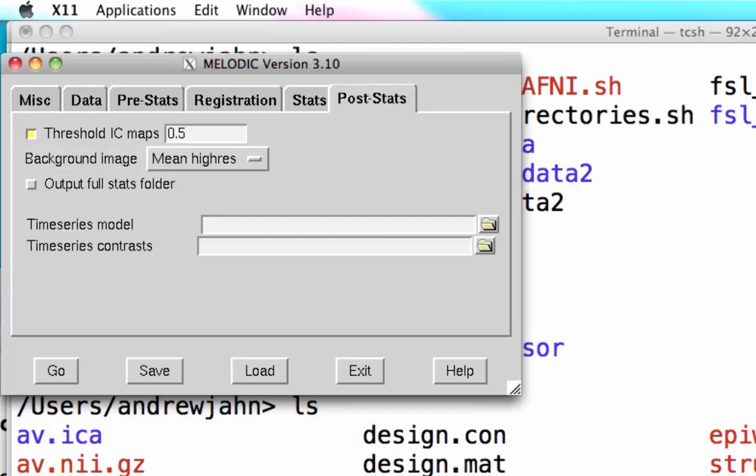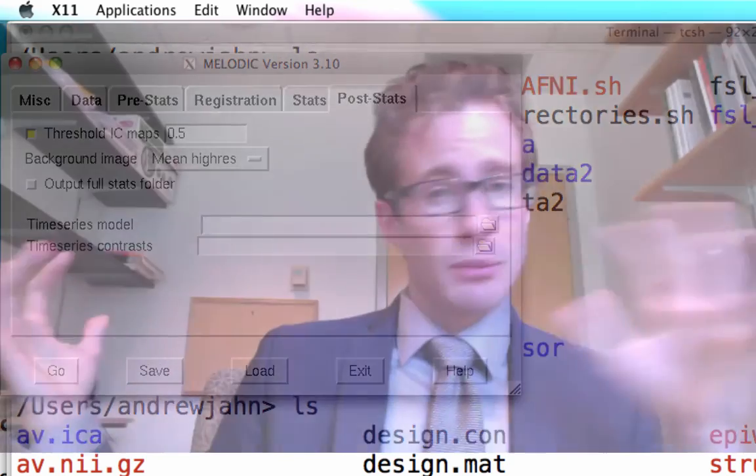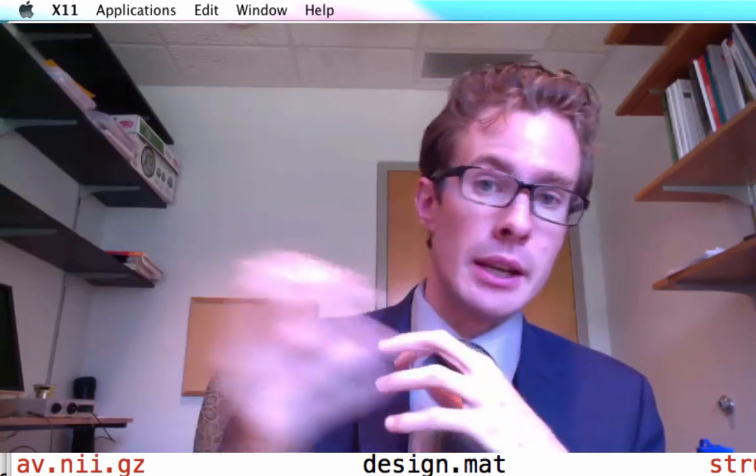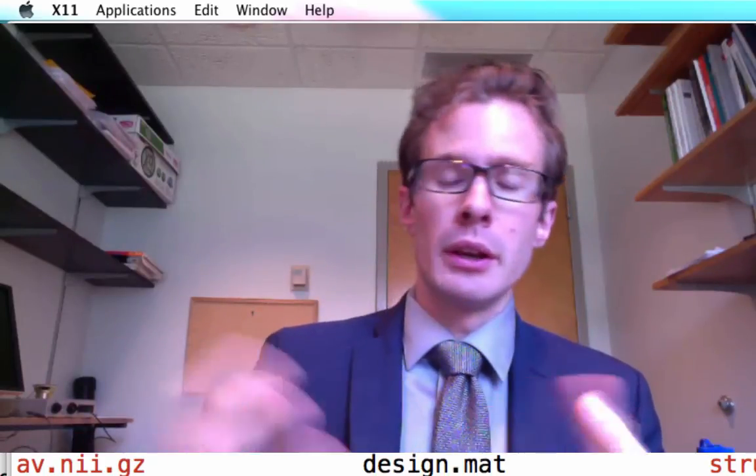So just a broad overview: how to get the data, where to find it, and how to open up the Melodic GUI and get acquainted with it before we actually do some of the work on the example data.